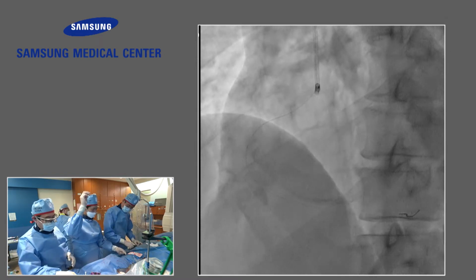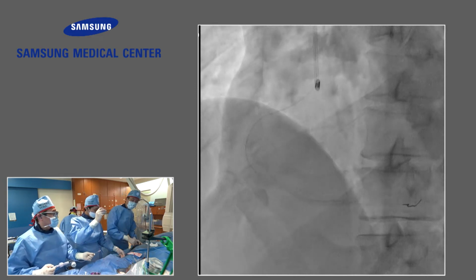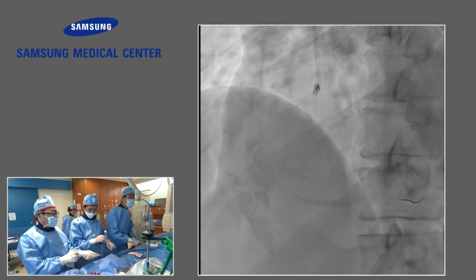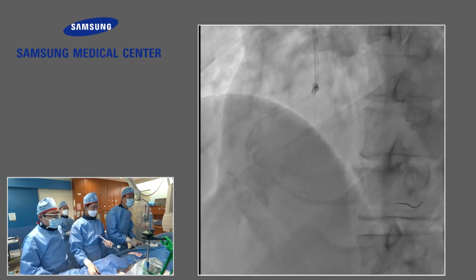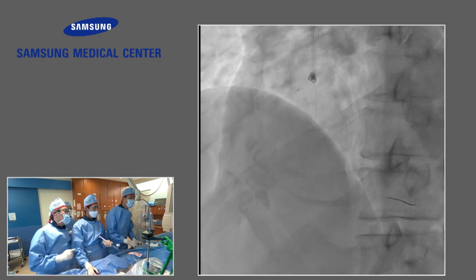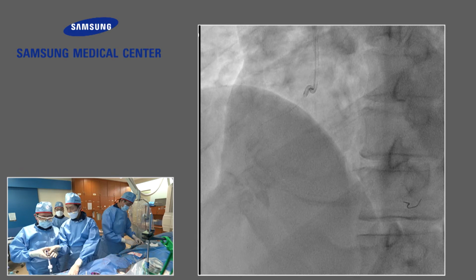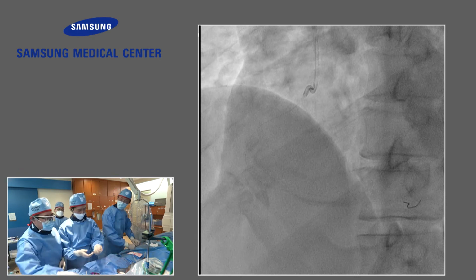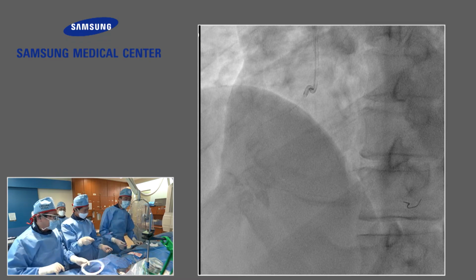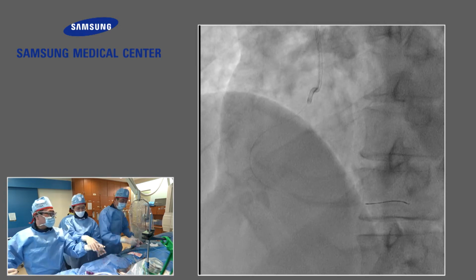Really? We knew that. Inflate is very useful. I learned it from Japanese doctors. I'm pretty sure. So I will be careful about the backup support. 2.5? 1.5. Dr. Lee is not well trained at SNU, I'm sorry. 1.5.